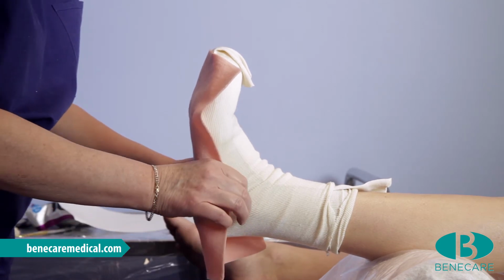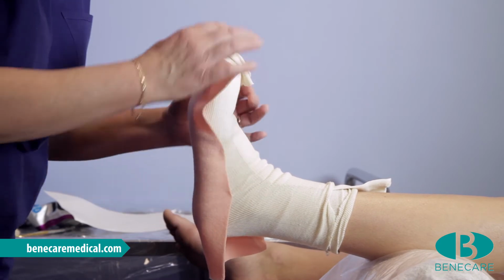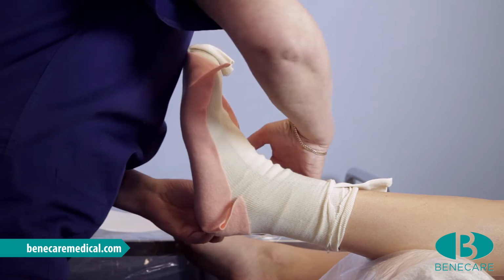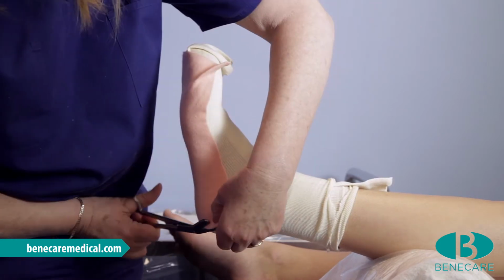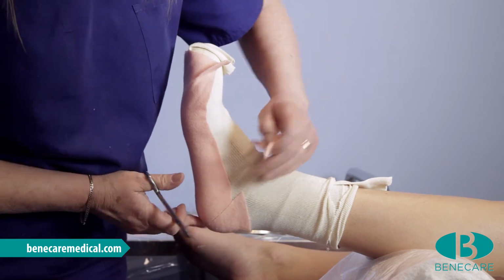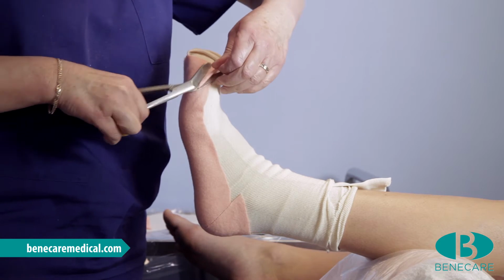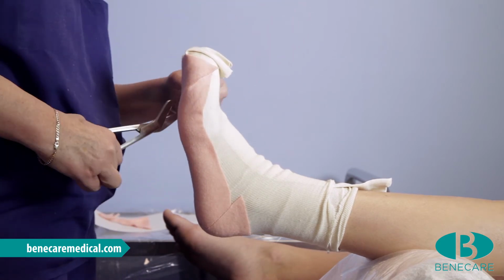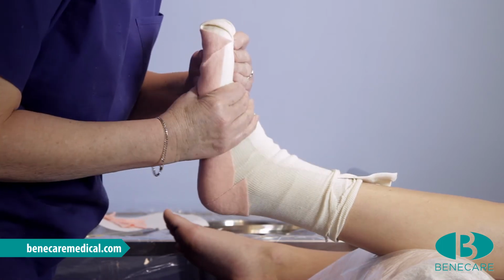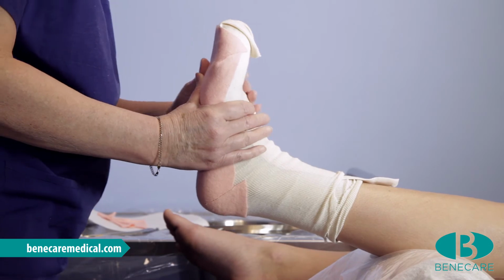Mould to the limb, ensuring you have excellent conformability with no wrinkles or ridges. Fold and pinch any excess and trim very close to the limb, ensuring it is smooth throughout. Ensure the limb is in the correct position before you start to cast.